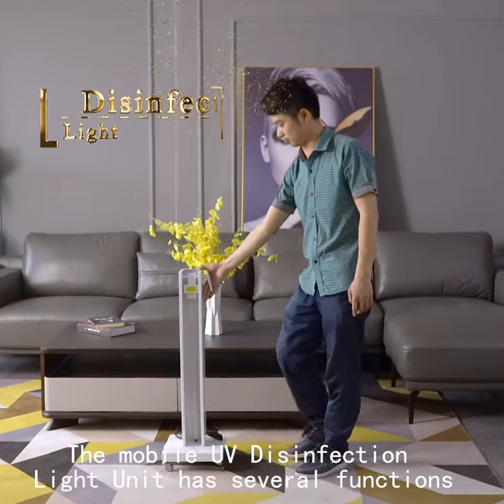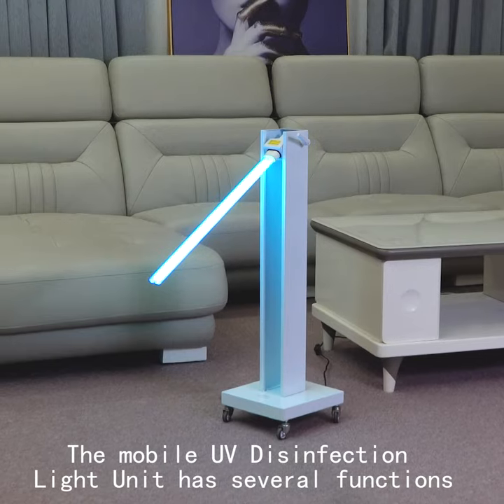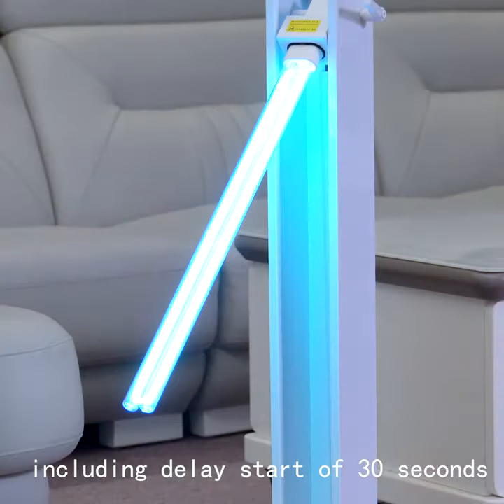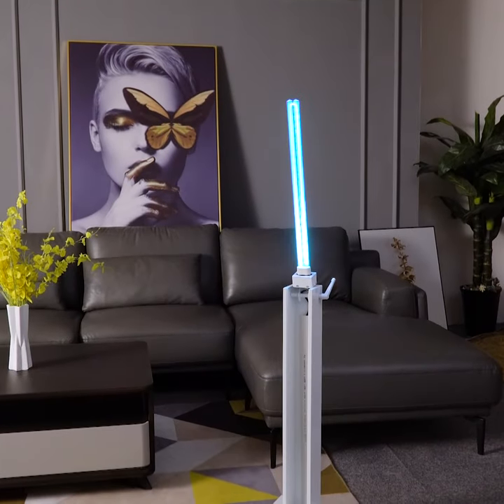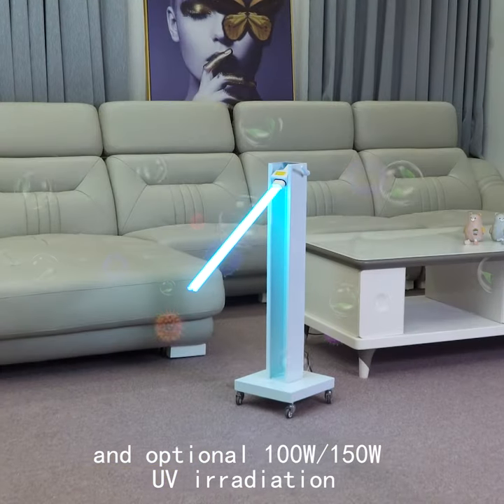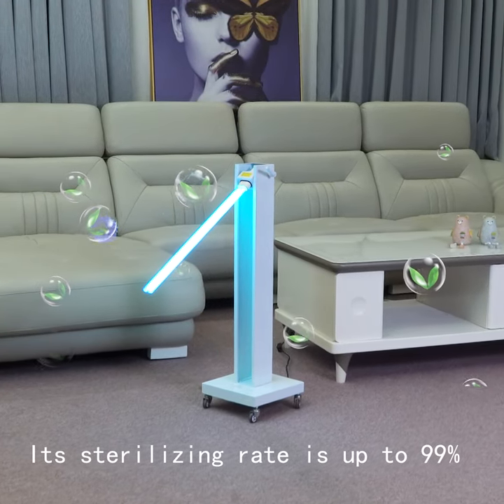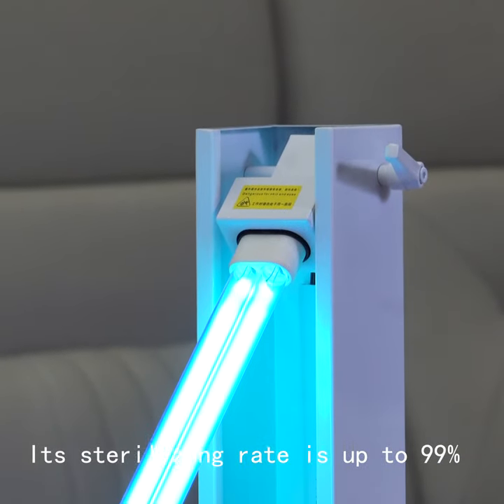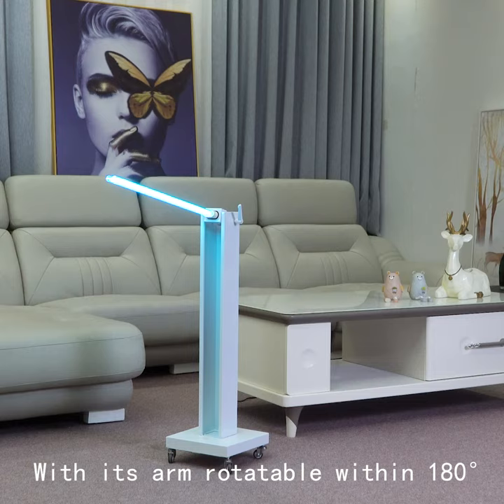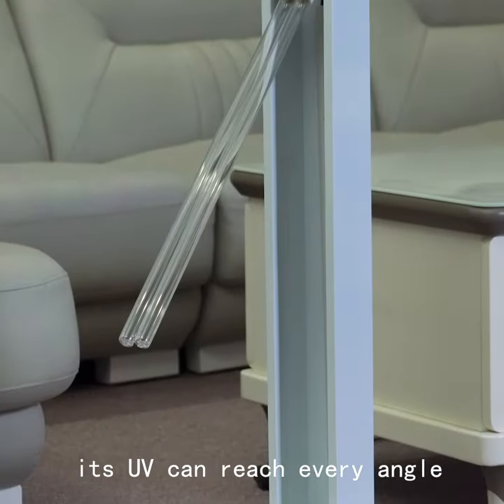The mobile UV disinfection light unit has several functions, including a delay start of 30 seconds and optional 100W or 150W UV irradiation. Its sterilizing rate is up to 99%. With its arm rotatable within 180 degrees, its UV can reach every angle.